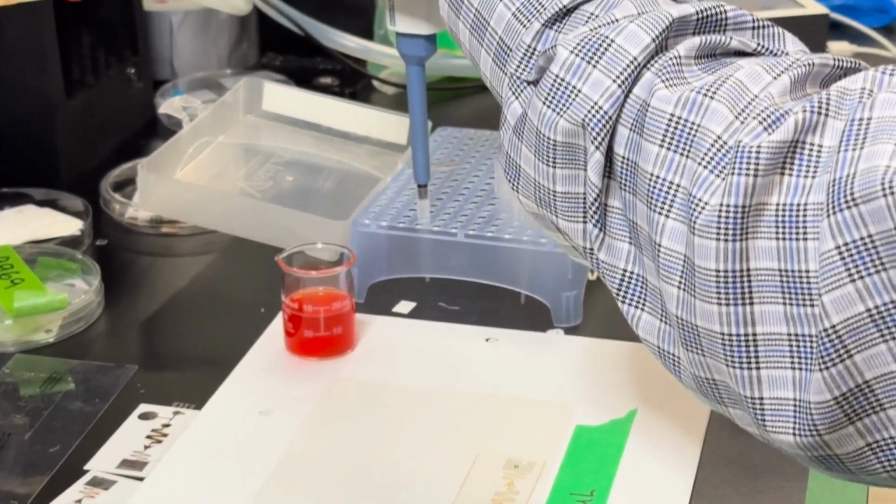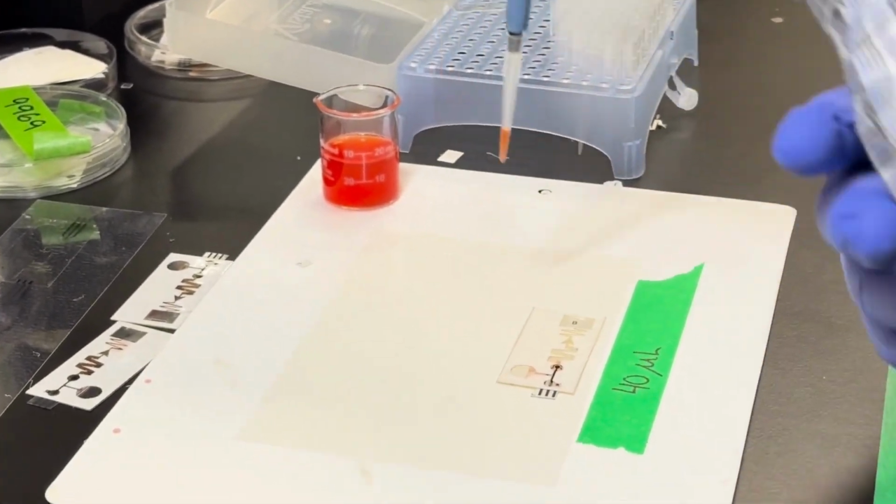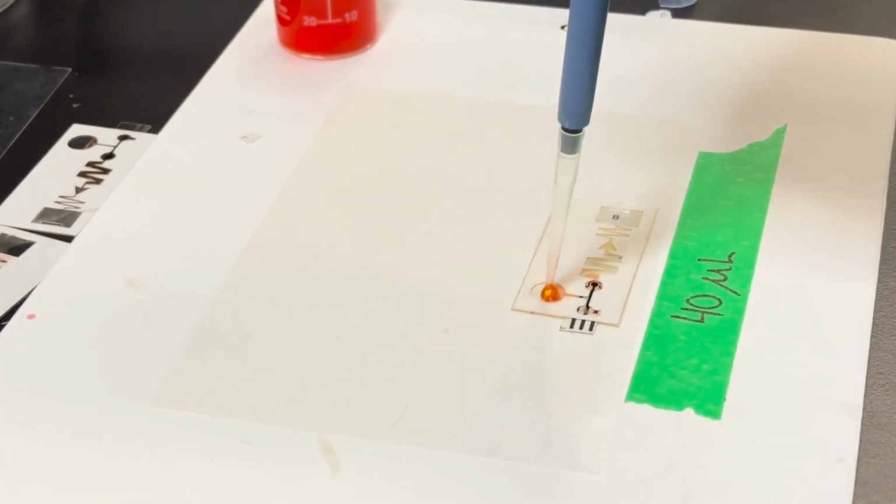So what we have developed is a microfluidic chip that has the ability to produce quantifiable results of cortisol levels within saliva. Now we have a simple task of taking a salivary sample from a patient, and the chip is able to process it within 10 minutes. Now in the lab, we have been testing for cortisol levels through saliva samples from individuals. It's a challenging way to test for cortisol, but we believe that this type of point-of-care testing is very necessary, and also the way of the future for medical diagnostics.